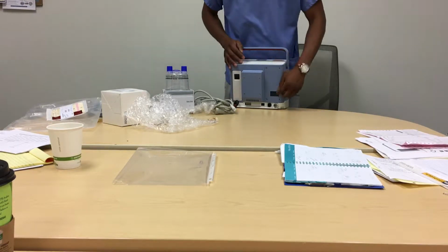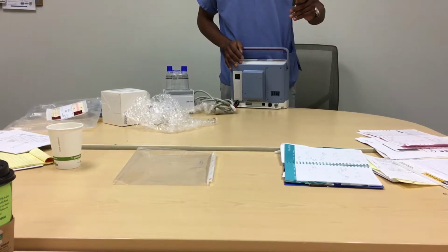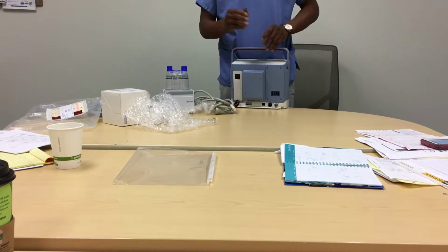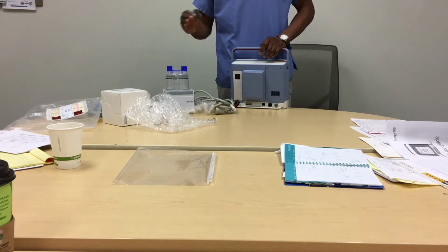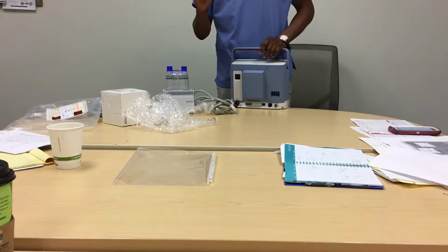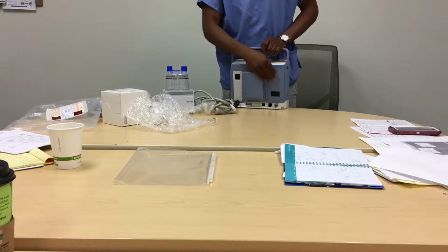All right. Right next to it, you have an air filter. I always recommend they wash it every week, the same as with the CPAPs, Respironics CPAPs, the DS560s. You wash it every week, change it every 6 months, according to what their insurance would pay for.